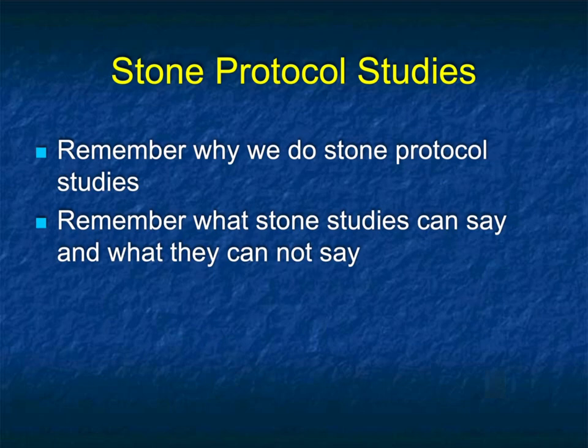Now, again, with stone protocols, when a patient has hematuria and the stone protocol is negative, it doesn't mean the study is negative. It means the stone protocol is negative. And I like to make that point because in the ER setting, if someone calls down and says, hey, the CT is negative, they're going to discharge the patient and not worry about it. What you need to be able to say is, and I'm not a hedger, look, there's no stone. But if hematuria persists, this patient needs to be worked up for hematuria.